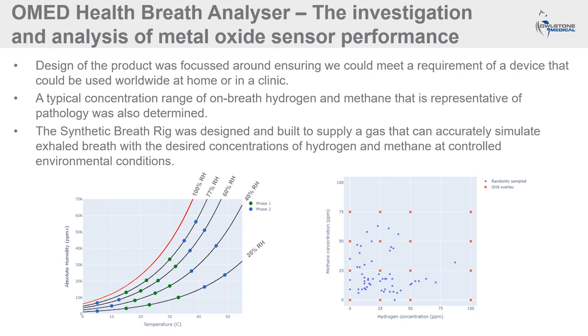As such, research was carried out to determine a window of ambient humidity and temperature values that would represent environments where these devices would be used. We then purchased an environmental test chamber that was capable of controlling the internal environment within this envelope.